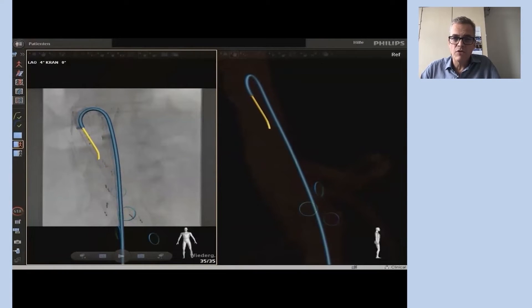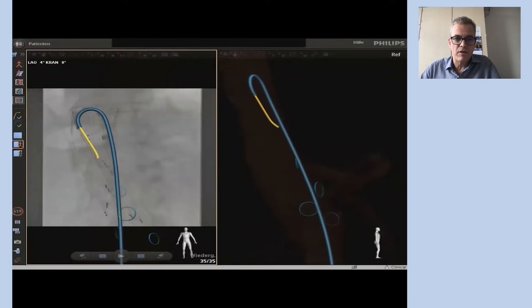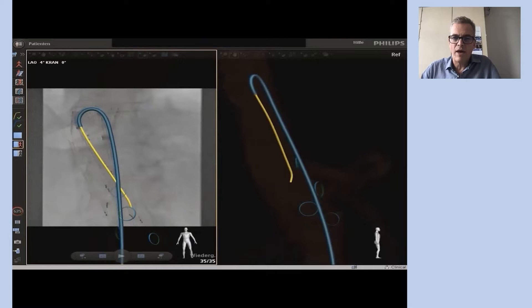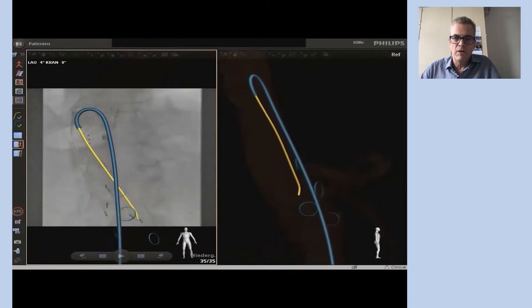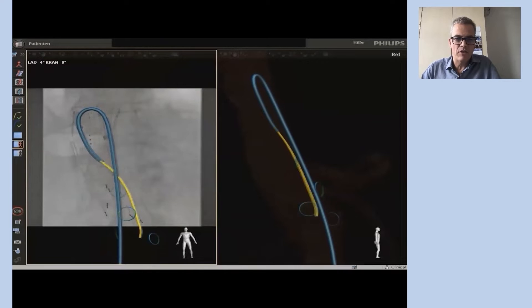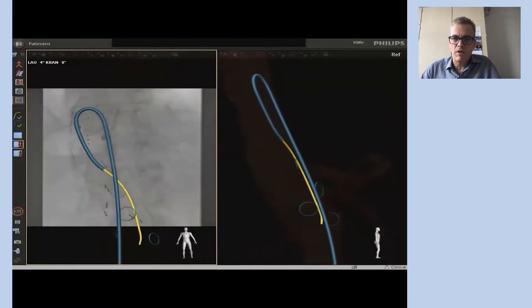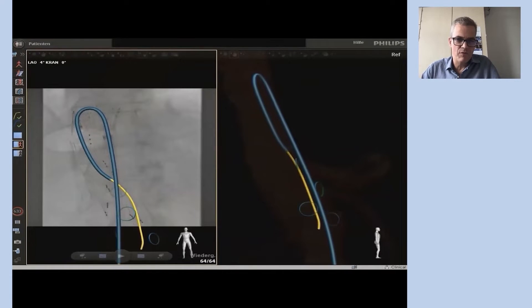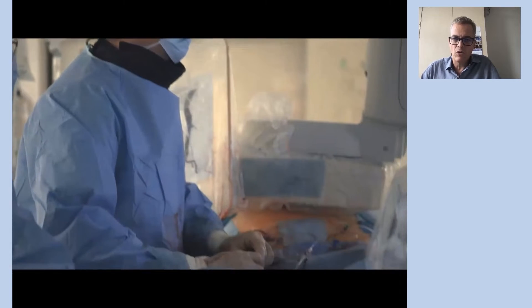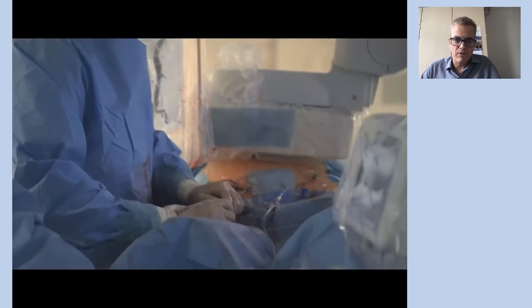Here the first target vessel is accessed using the FORCE wire. You see how helpful the biplanar visualization and the 3D animation is, as we instantly understand whether our devices point towards the ventral or the dorsal aspect, and it didn't take long to get this branch.